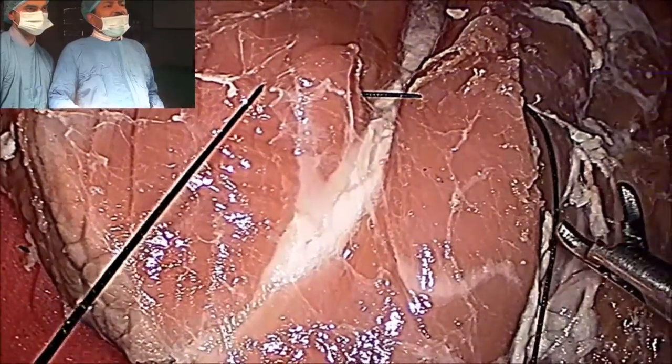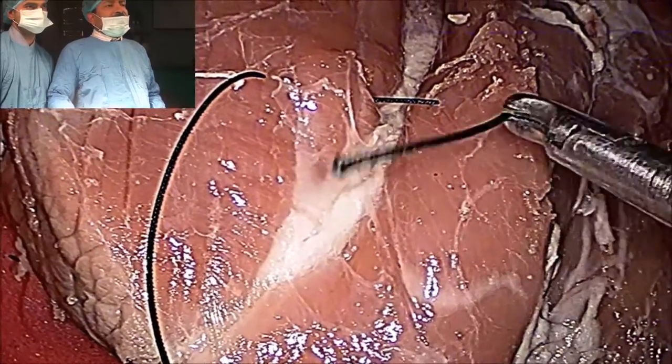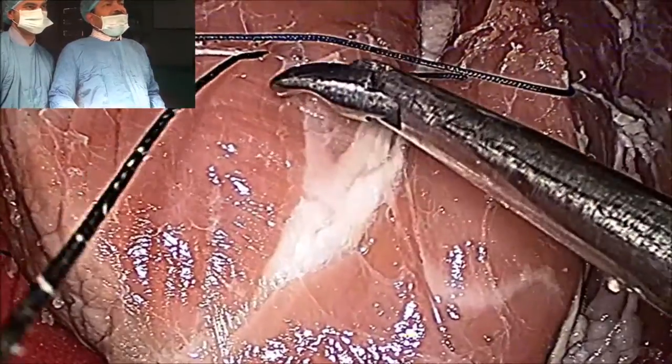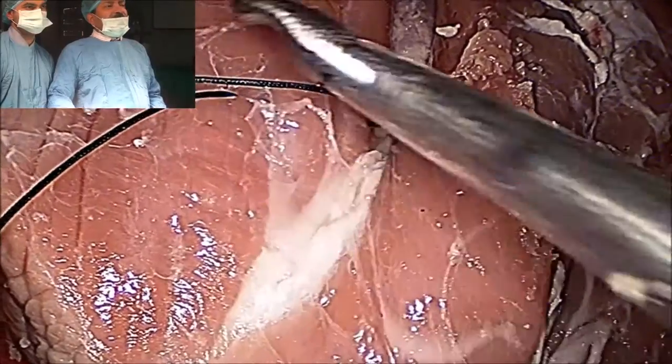One of the requirements of the tumble square knot is that the tail should be long. The tail should be 2 cm plus the defect. Suppose the defect is 2 and 2, that is 4 cm — then the tail should be 6 cm long.